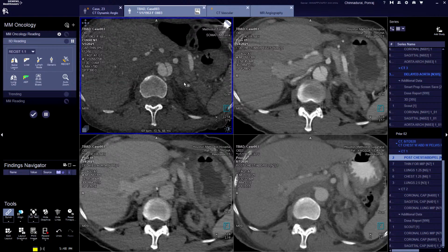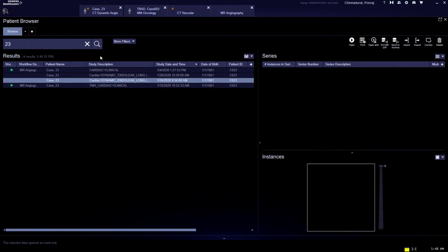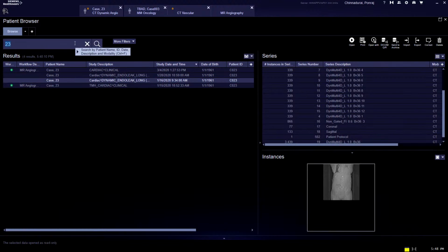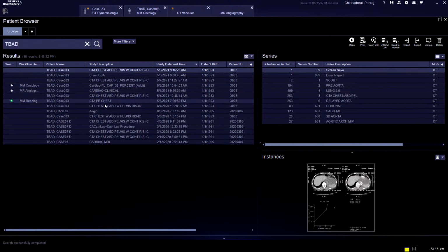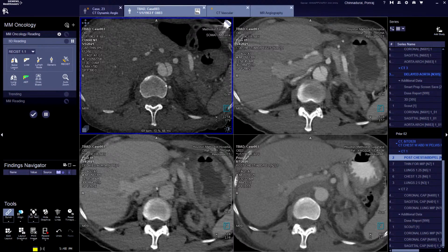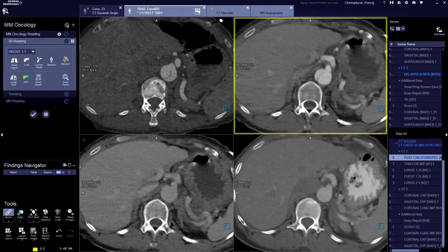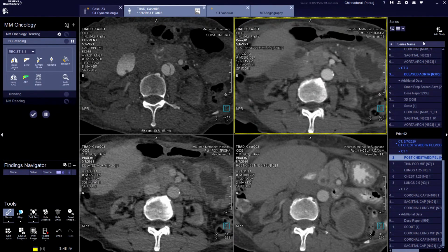Okay, and are these two different CAT scans we're looking at? Yeah, so what I did is take, starting from the patient's CT images, the value of this is... So we all go to clinic and we all spend a lot of time, and typically we pull up one CAT scan, we go, well, has it changed? So we get rid of that, pull up another CAT scan, scroll through all of this. What you're saying is that using this system we can pull up two or three at different time points, line them up side by side and scroll through them, and it'll be roughly the same level.